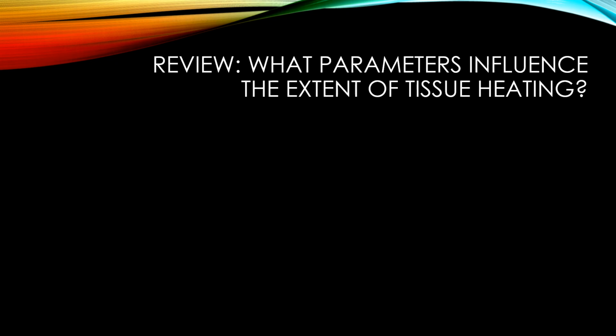To some extent ERA, simply because if you interpret extent of tissue heating as to how much tissue is heated, ERA will certainly influence that. And certainly coverage area. If you take that same amount of ultrasound and spread it over a larger area, it's not going to heat as much as that same amount of ultrasound applied over a smaller area.